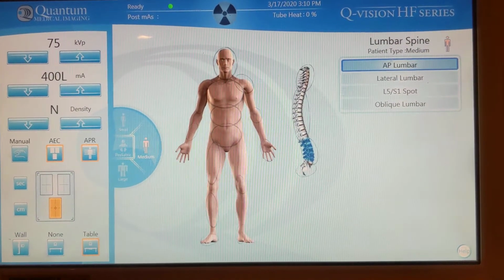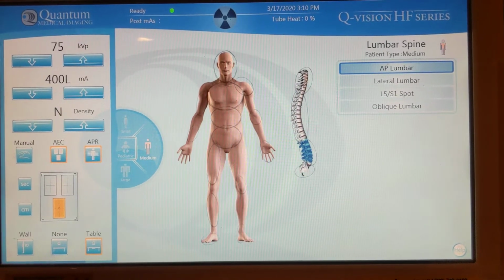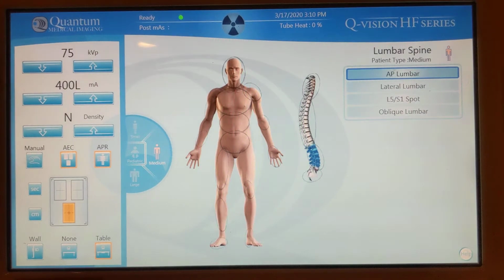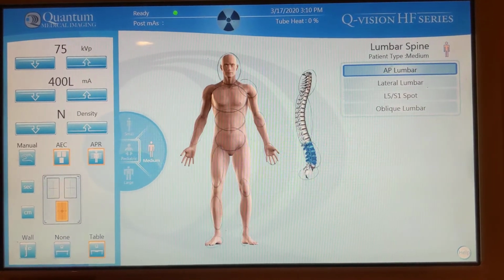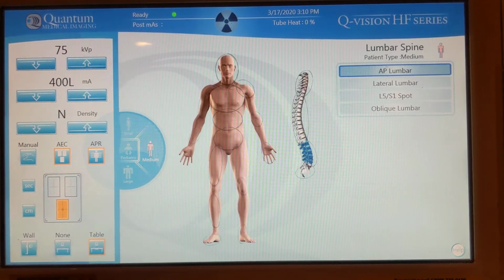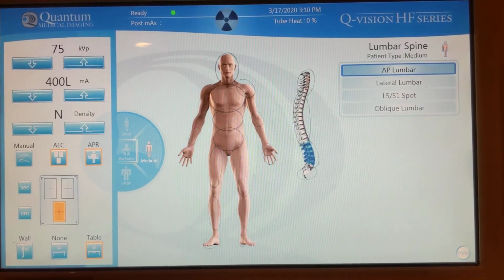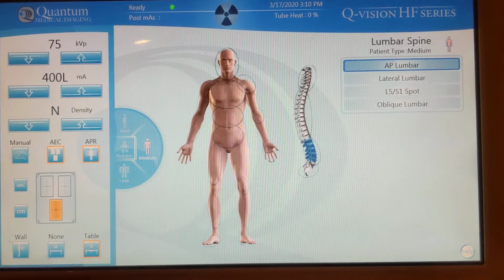So for the most part, this is just a rough overview of AEC using the control panel, just so you have that information. And we will still cover a lecture point on this to cover all of the individual key points of AEC, and when we do that, we'll do it by Zoom, and we'll be able to have interactive discussion along with that.